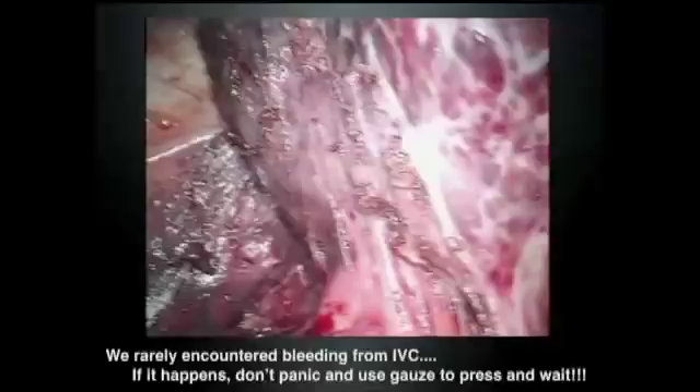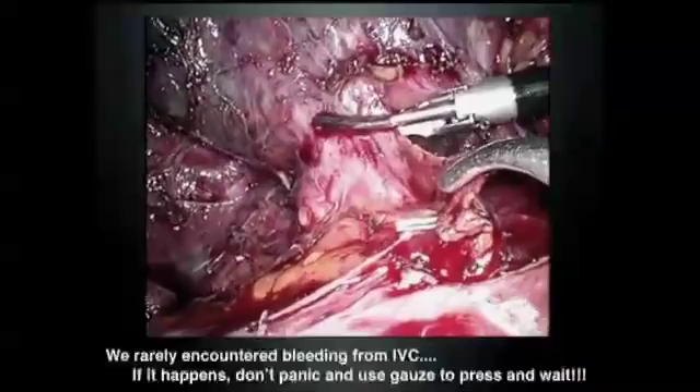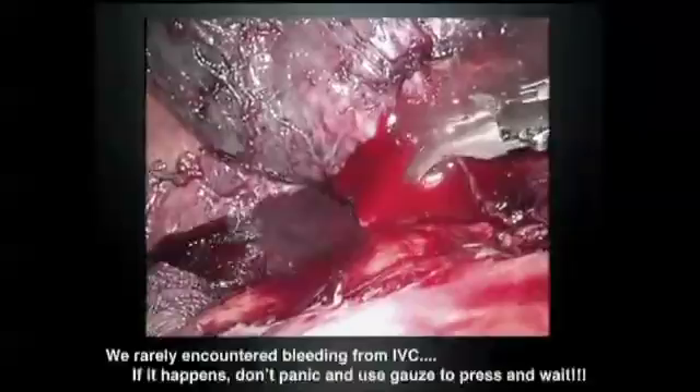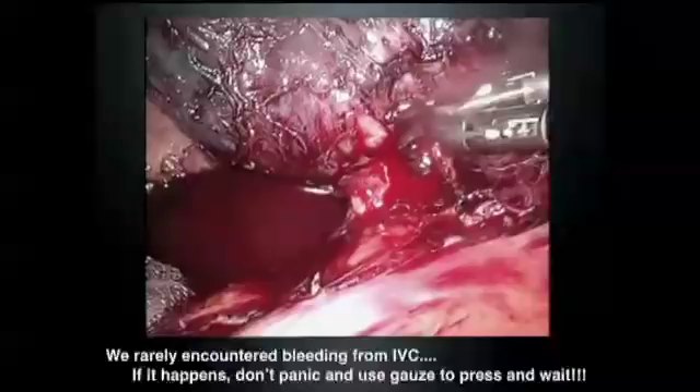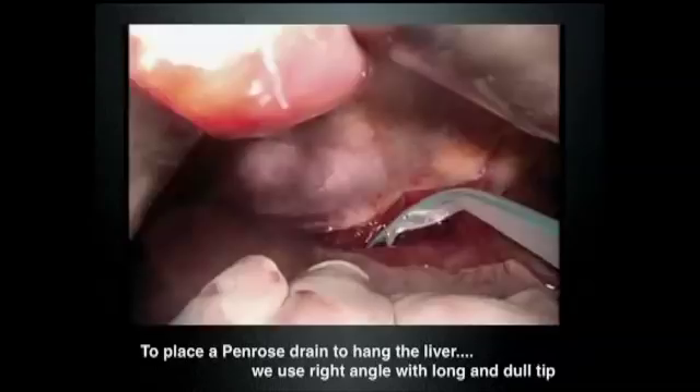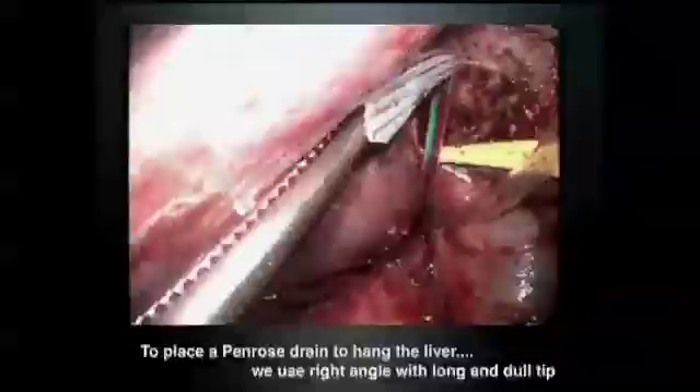Sometimes bleeding from the vena cava occurs — the adrenal gland is very adherent to the cirrhotic liver, and this can happen especially in the early phase of the procedure. Bleeding from the vena cava is very scary, but don't panic. Just place gauze, return the liver to position to stop the bleeding. Then after parenchyma transection, take out the liver and close from the small laparotomy. So the laparoscopic-assisted way is very useful even for bleeding from the vena cava. For this procedure, we need to have a Penrose drain placed between the vena cava and the liver.